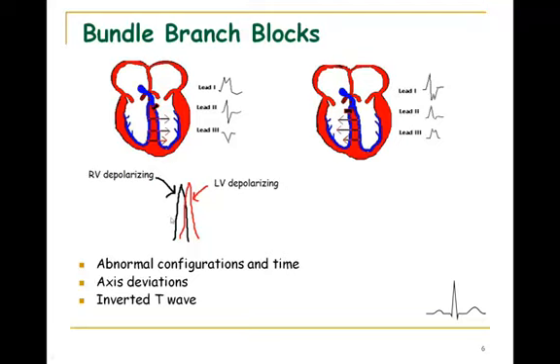But what they have in common is that the QRS duration is prolonged. The QRS will be prolonged, but generally it's usually a little bit longer with hypertrophy, but you may not always see that. So on average with right ventricular hypertrophy or left ventricular hypertrophy, you may have a QRS duration of say 0.1 to 0.12 seconds.